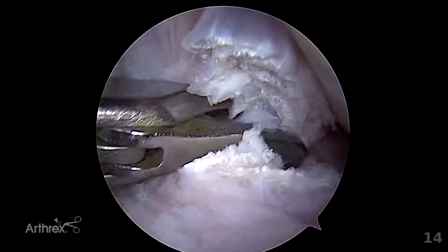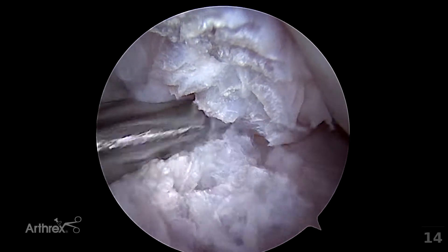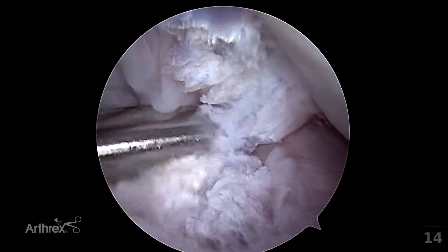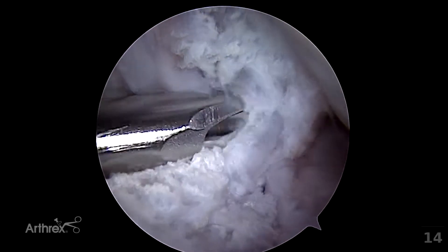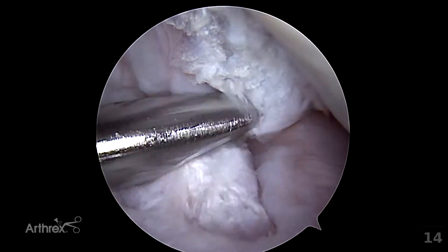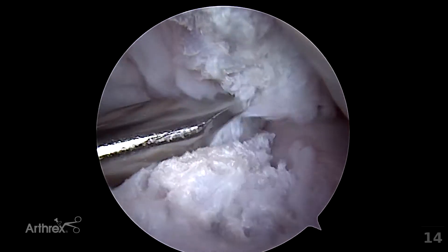If difficulty is found, the shaver can be replaced into the joint. The three millimeter dissector is used in an oscillating fashion to remove and open the cut ends of the cranial cruciate ligament to determine the completeness of transection. A residual band may be visualized on the caudal aspect of this ligament. Once that has been performed successfully, the punch can be replaced into the joint if necessary to cut the remnants, or the shaver may be used for this purpose.